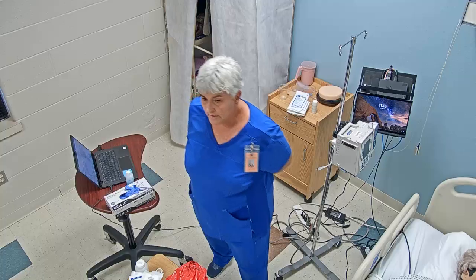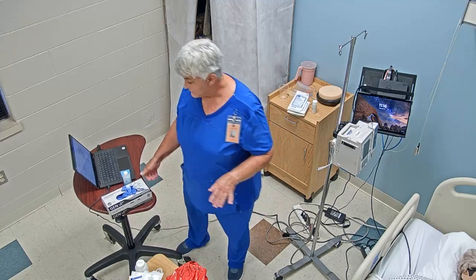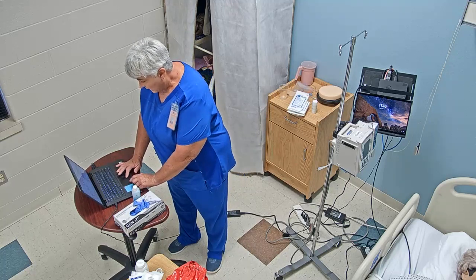We're going to be demonstrating how to do a dry dressing change today. I'm going to be starting at the nurse's station. While I'm at the nurse's station, the first thing I'm going to do is pull up my doctor's orders to see.